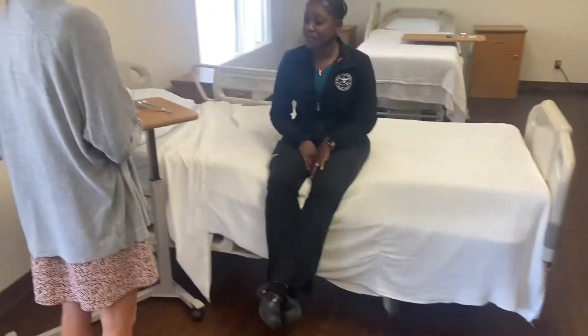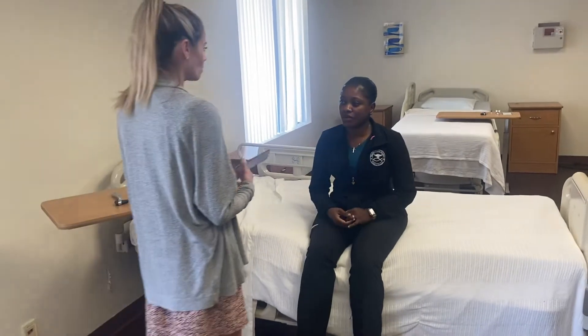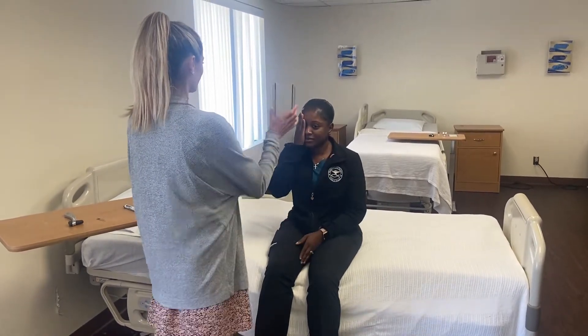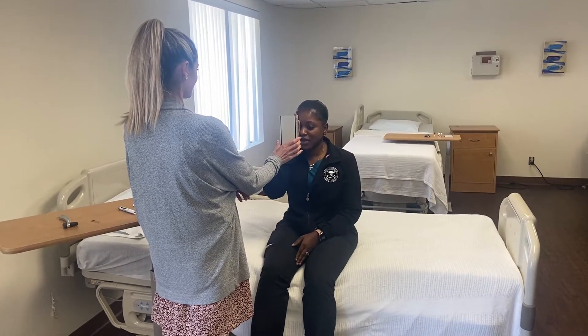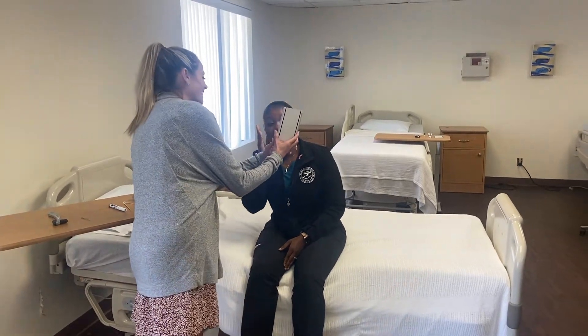First we're going to check your visual acuity. Do you wear contacts? No? So for this test I'm going to hold this card 14 inches from your eyes, have you cover one eye, and read the lowest line that you can — just the numbers. The card is held in good light, 14 inches from the eye.